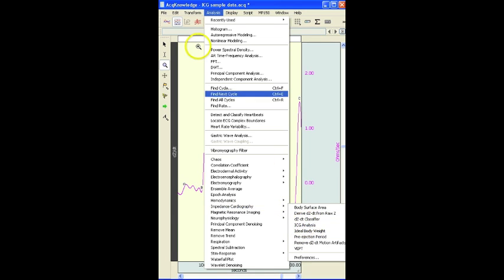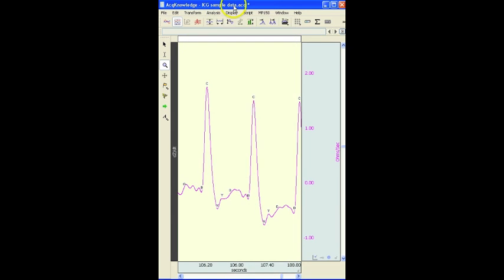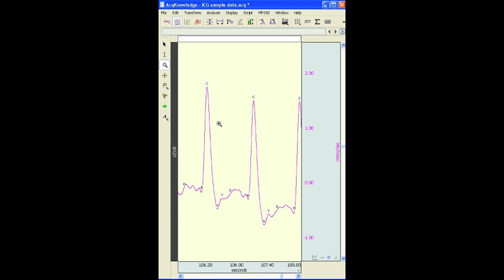Basically the software will go through, look at these different points in the complex and provide a series of measurements such as stroke volume, cardiac output, and a number of other values, pre-ejection period, etc.